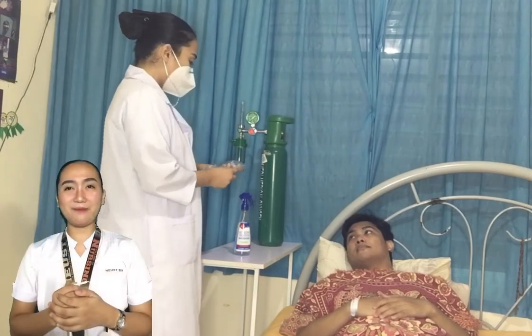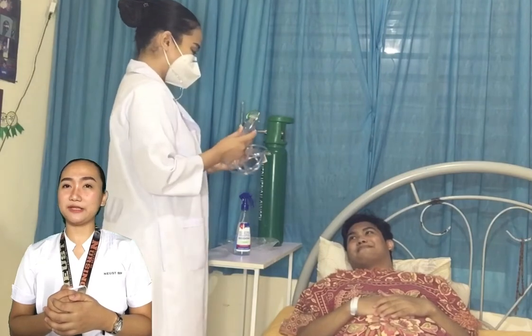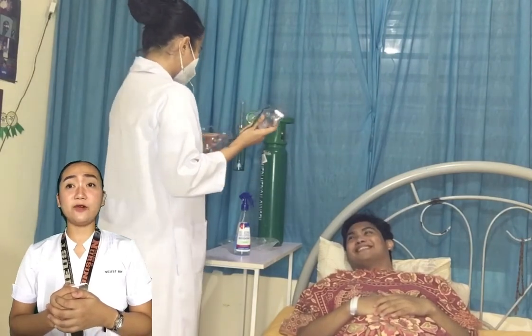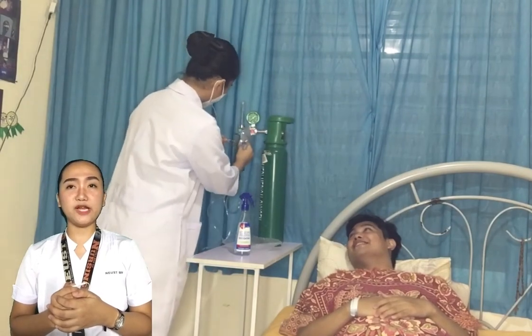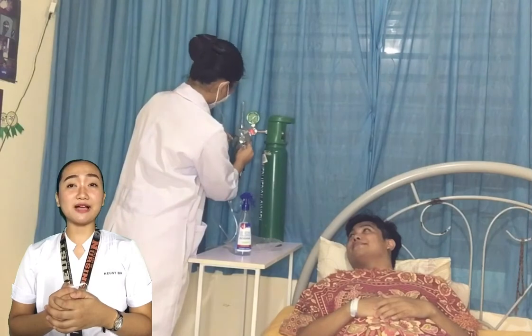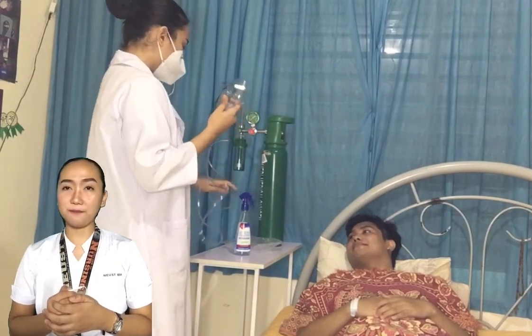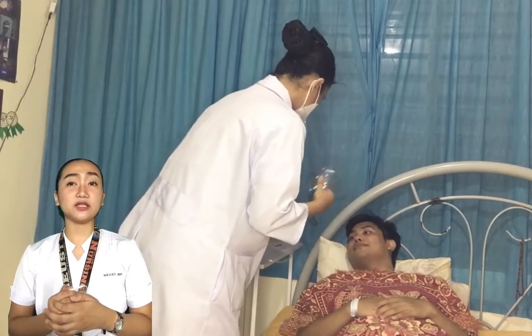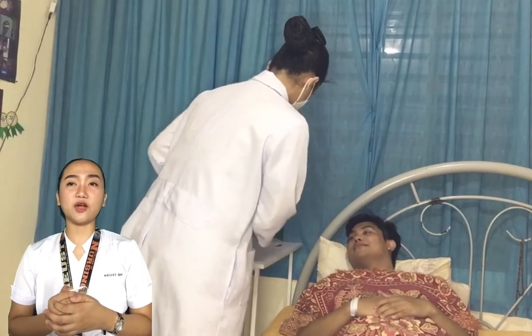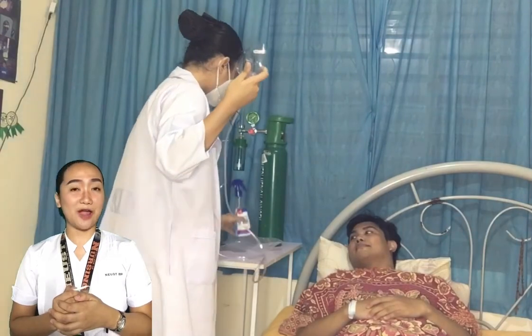Attach the mask to the oxygen source. Select the flow of oxygen at the specific prescribed rate. For a non-rebreather mask, be sure to allow oxygen to fill the reservoir bag before proceeding to the next step. Position the face mask over the patient's nose and mouth. Adjust the elastic strap so that the mask fits snugly but comfortably on the face. Adjust the flow rate to the prescribed rate.